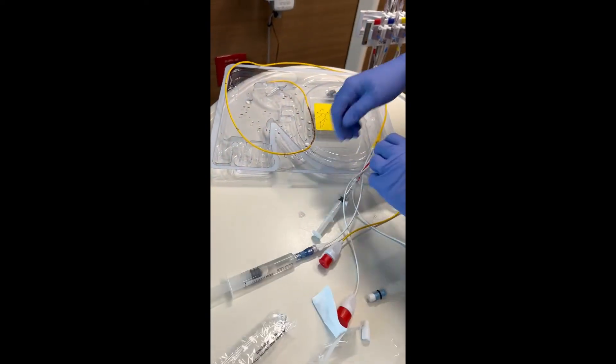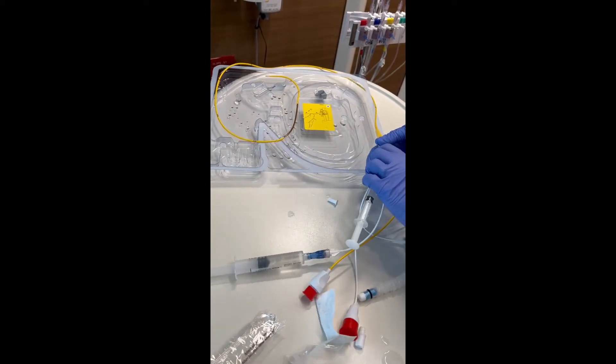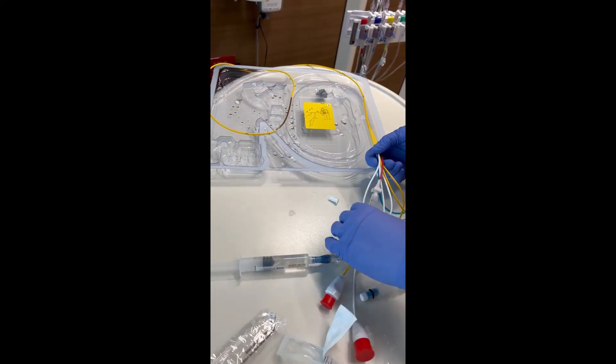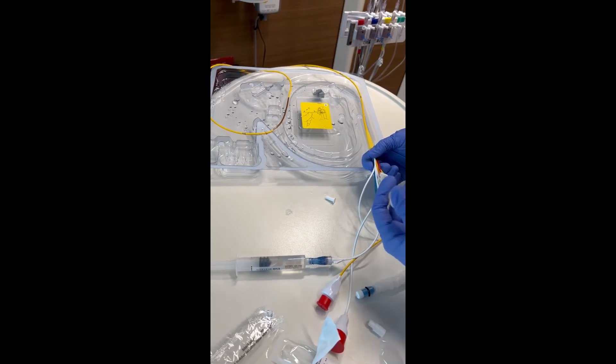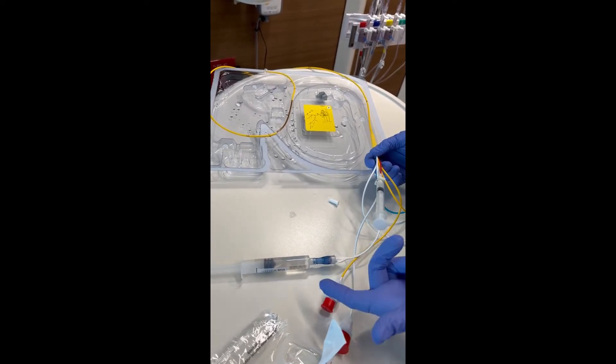So now that we've got all these hooked up and primed, as the physician's inserting it, he'll tell you when to inflate the balloon and deflate the balloon.